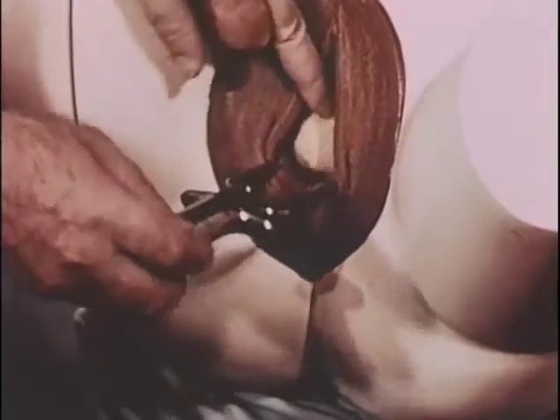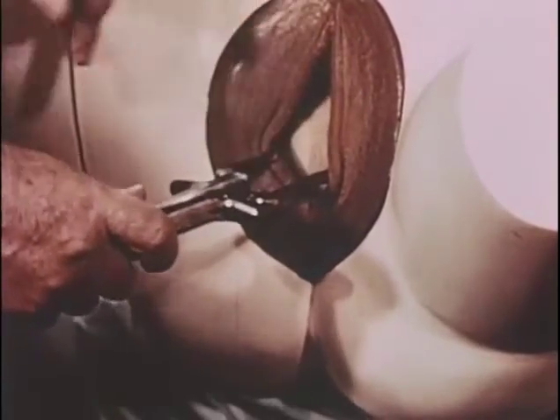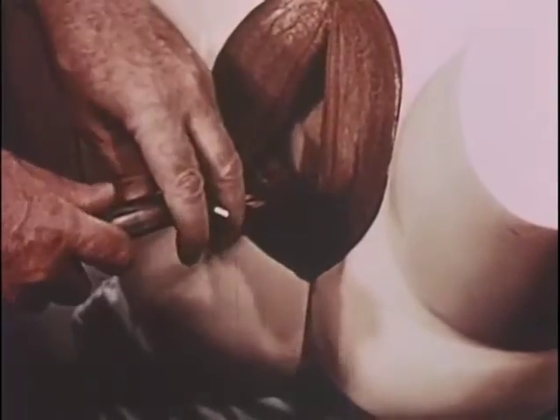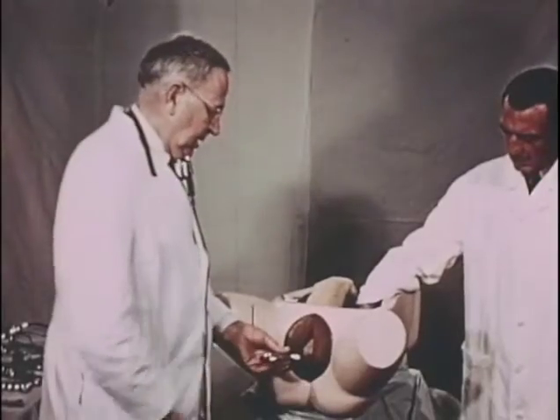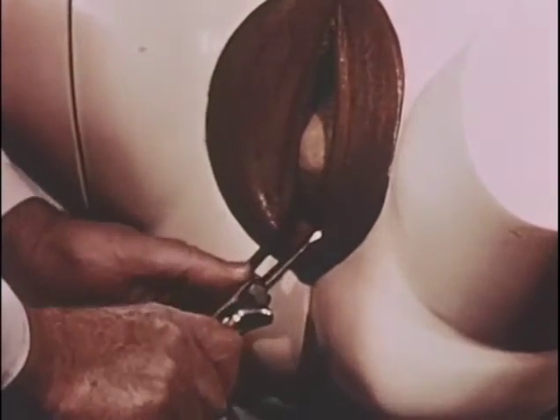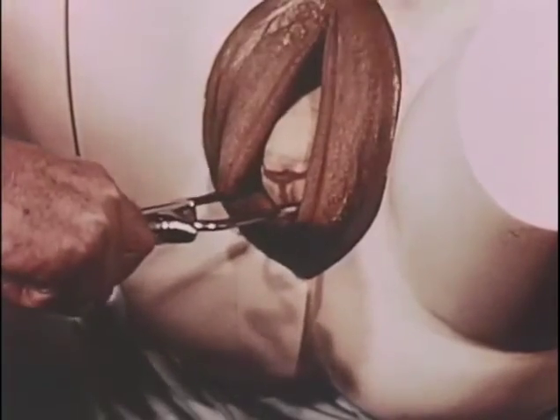If the fontanelle is less than the finger's breadth above the shanks, it's an overflexed head. And traction on this would cause the head to hit the perineum and would not go through the mechanism of extension as readily as it would in its normal position. Here again, the correction is easy. Unlock, depress the handles until the posterior fontanelle appears above the plane of the shanks, about a finger's breadth, then compress and elevate slightly.